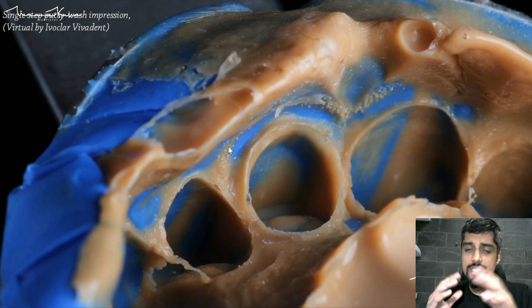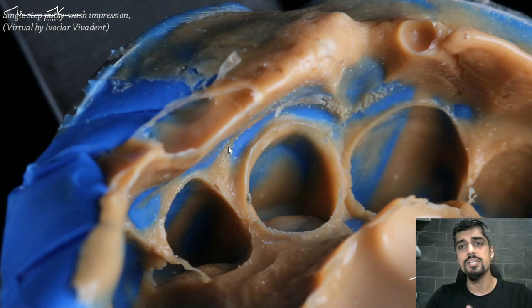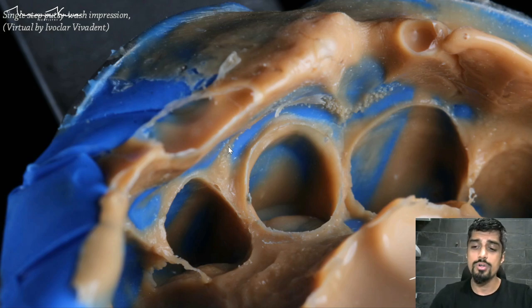This is the kind of dry impression that you need, because unfortunately all the impression materials we are using today are still somewhat hydrophobic — which means they run away from water and moisture. So you need a very, very dry surface, almost as much as when you're doing a composite restoration. We need a very dry field to make a good impression.